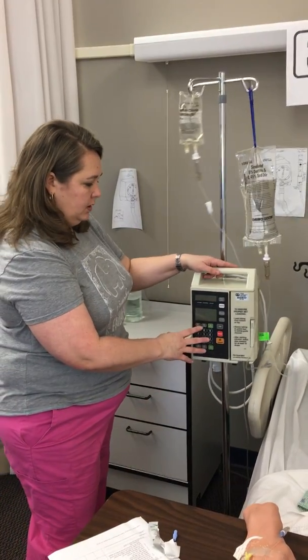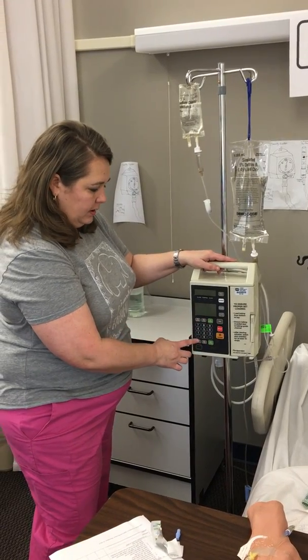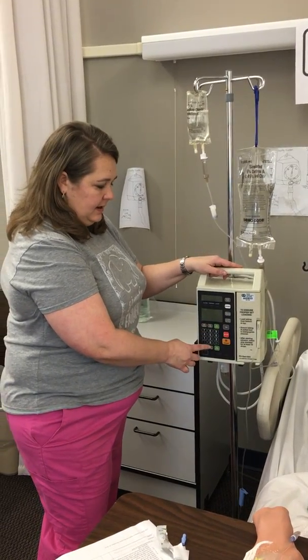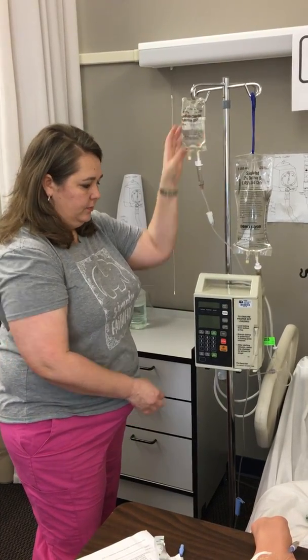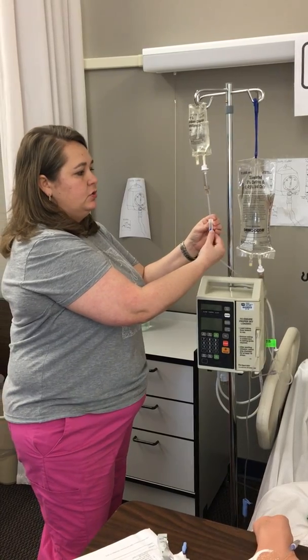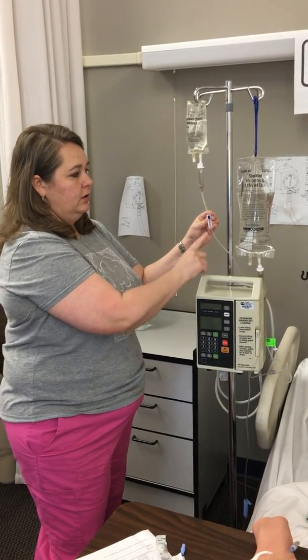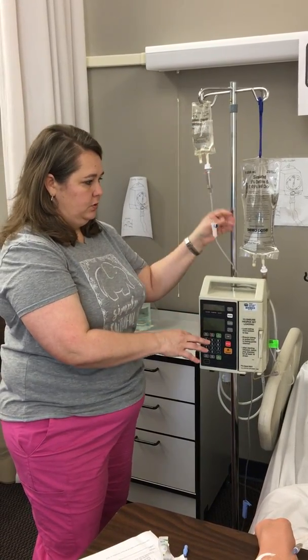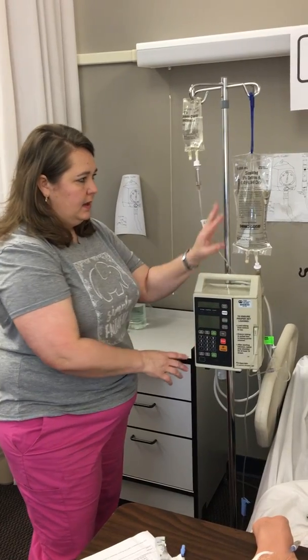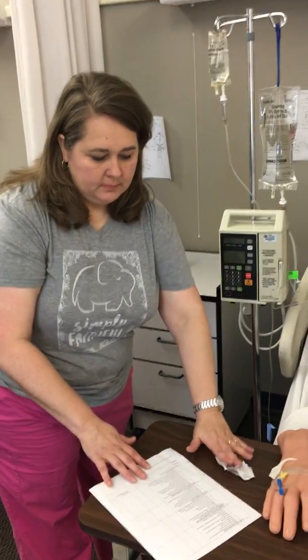Now I want to calculate the correct secondary rate, dial that in, and set your volume to be infused to whatever volume is in your bag, then start that. Be sure that you unclamp your secondary tube before you step away from your patient — otherwise it's not going to infuse. Once the piggyback is complete, your primary will begin running again. At this point I will wash my hands and document appropriately.